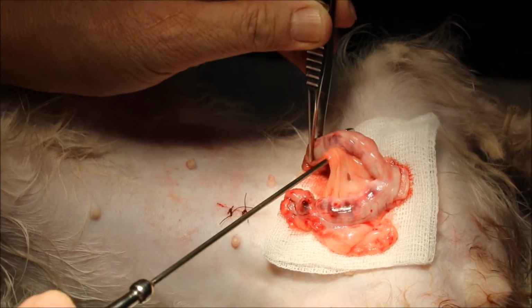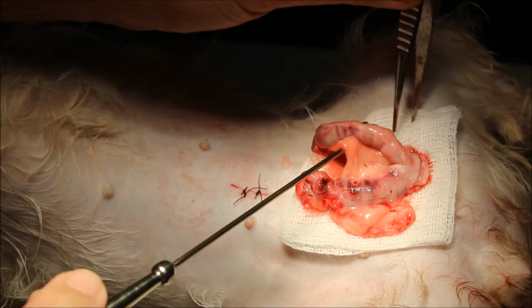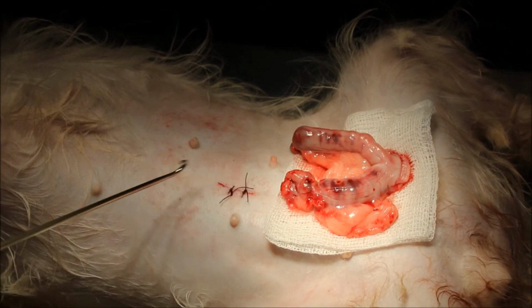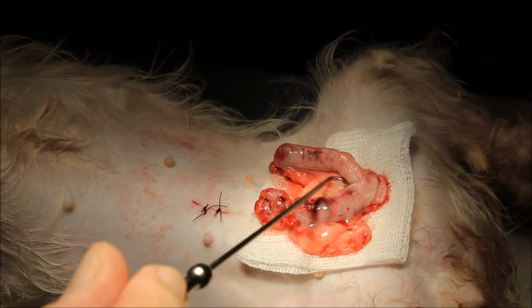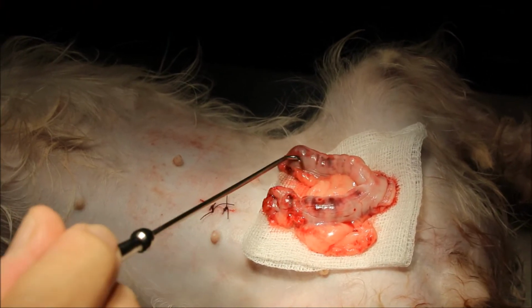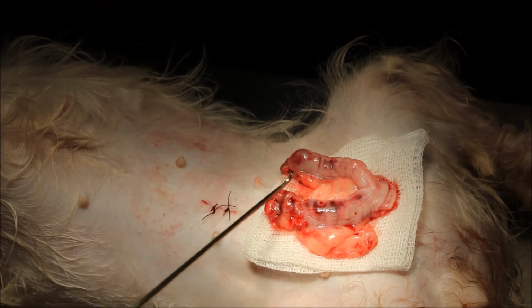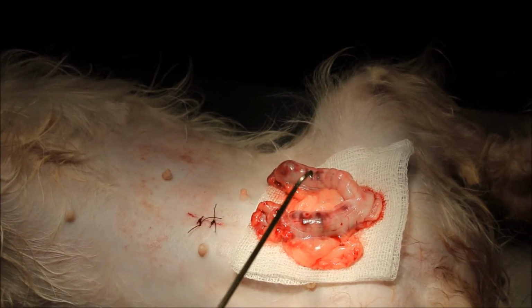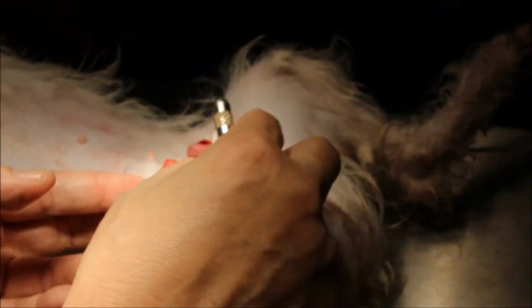It's easier said than done actually, but of course for me, I have so many years of experience, so I can manage to get it. Even for this dog, it's the third time. So I did one time, nothing. 2 times, nothing. The third time, the uterine horn was hooked up. So I will consider that a relief, because sometimes it's really hard to get it. So once you hook out, then the other thing is just tie and all this. So I won't explain that. That one is the standard.